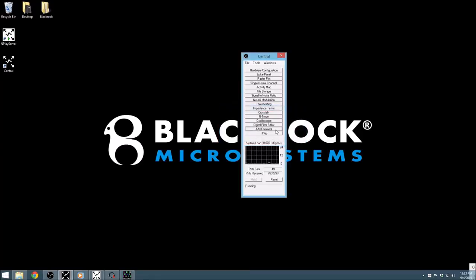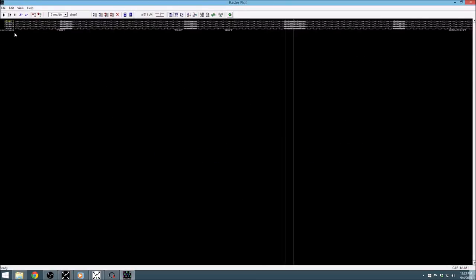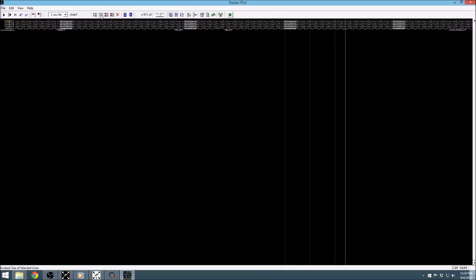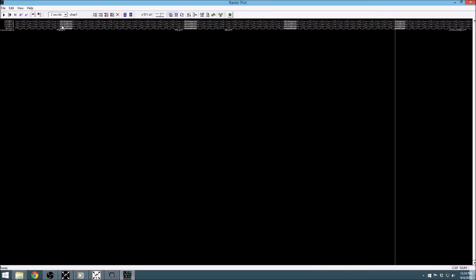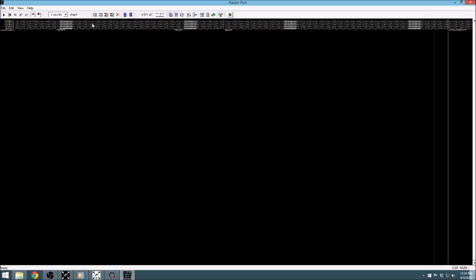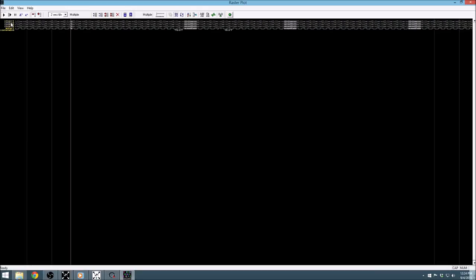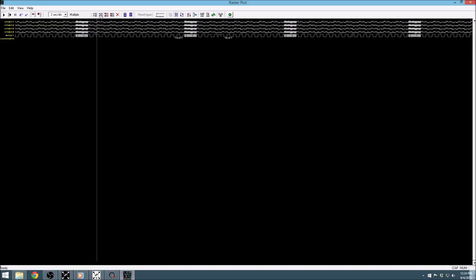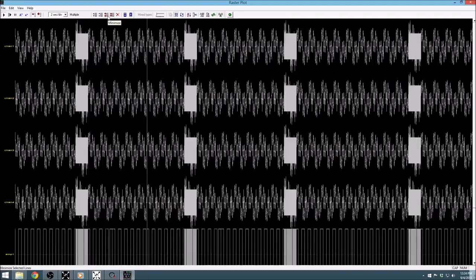Now that we have our chosen channels in the raster plot and are showing the proper data, it is time to start customizing the appearance. Selected channels have their display size increased or decreased using the expand or contract icons in the toolbar. The red arrows will simply minimize or maximize the channel's display size. Like many of our other applications, selecting multiple channels will allow single channel functions to be used on multiple channels at once. After selecting multiple channels, we can see that I am able to adjust the display size for all of them at the same time.